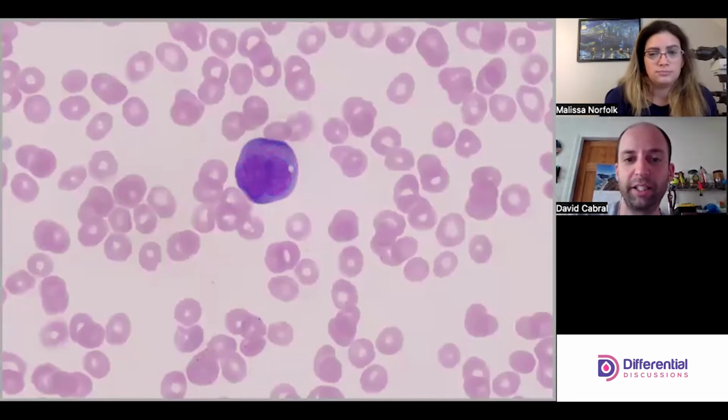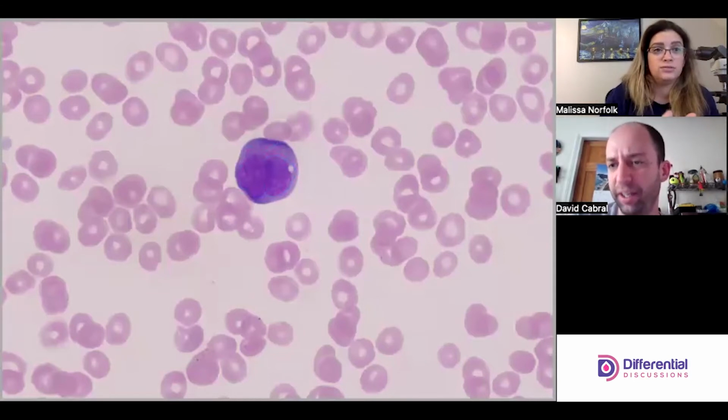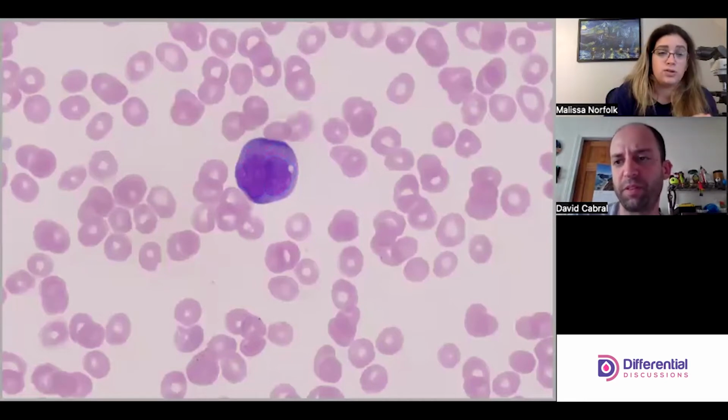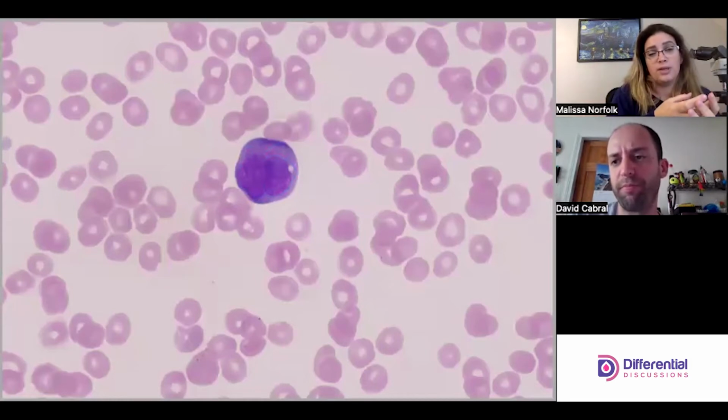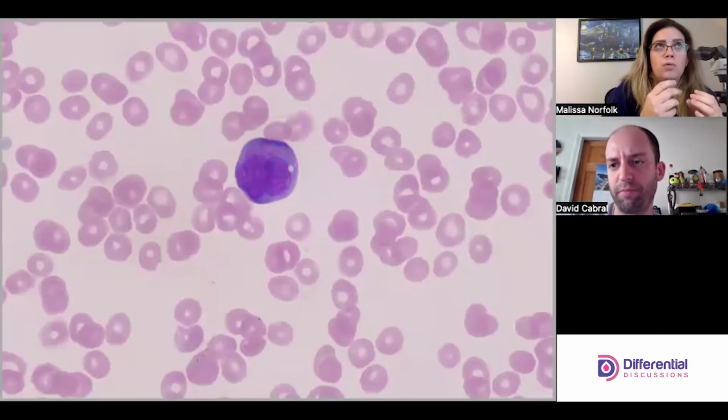Yeah, so really easy to identify, diagnose, and relatively easy to treat too. I think we're not really on that side of things, but now that they have ATRA, the retinoic acid in a different conformation, like Dave was just talking about. So we can give them all-trans retinoic acid, a different conformation, that overcomes the ability to bind to the retinoic acid receptor, and so it binds and the cells can proceed past maturation. So it's another way where you can treat for the pathophysiology of a particular genetic abnormality.